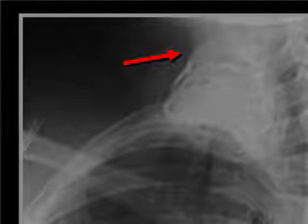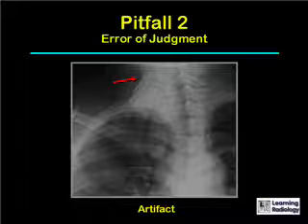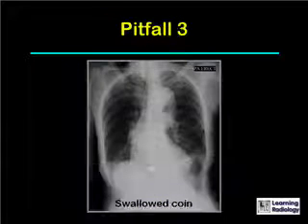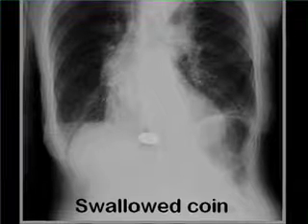It's the patient's hair, which is gathered together in an elastic called a scrunchie. Artifacts can introduce a whole series of pitfalls and lead to errors in judgment, so it's important that the patient be wearing only a gown and that all other extraneous materials which can produce artifacts be removed from around the patient.